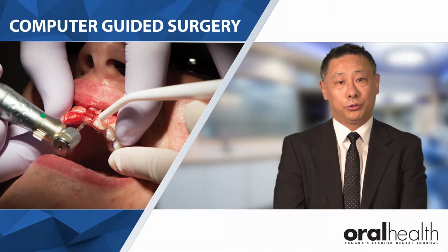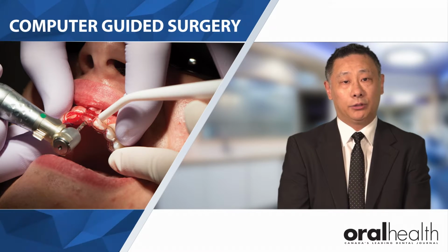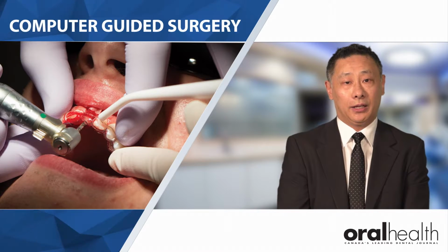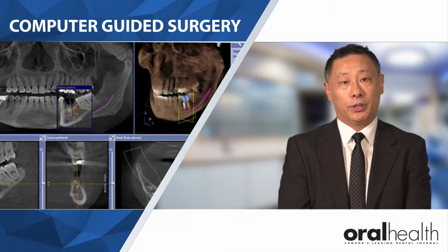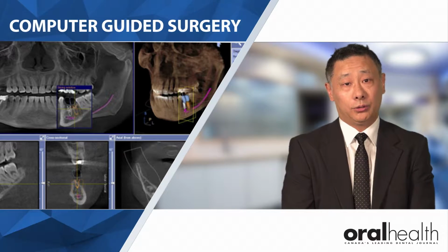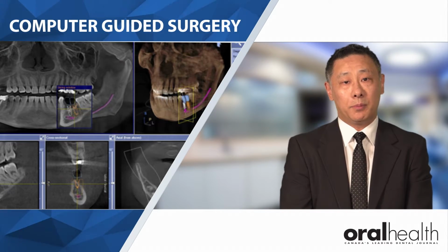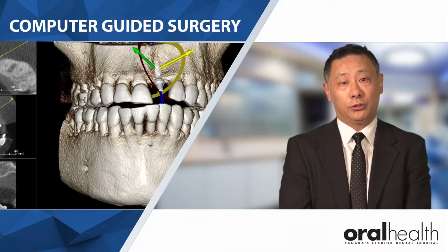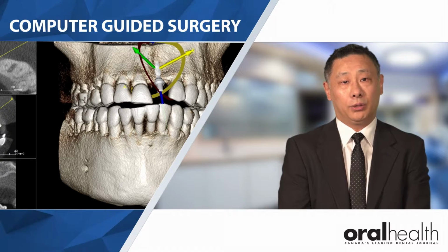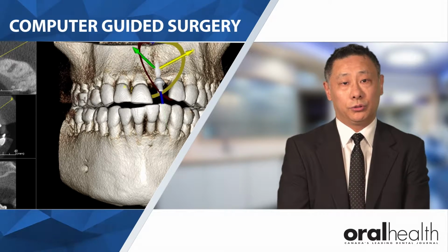The computer-guided surgery will give us the benefit of utilizing the cone beam to treatment plan the exact position, angulation, depth, and width of implant positioning. And with the guided surgery, the clinician will be provided these very specific guides and or drill sizes that at the time of surgery, we don't have the luxury or the ability to change or misangle. So this is what we call computer-guided surgery. Some of the issues, of course, are treatment planning and additional costs involved in terms of computer-guided surgeries.